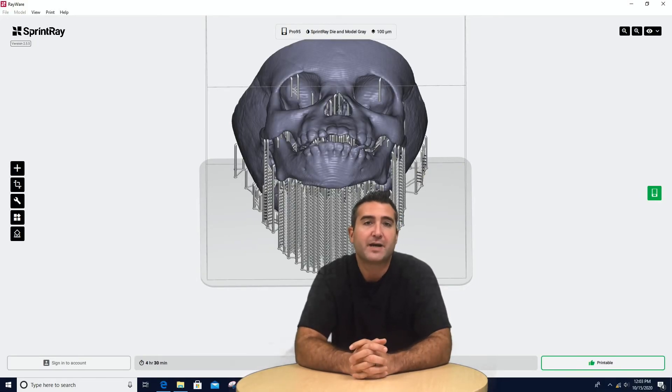Here we can see the file we received back from Romexis — literally five seconds and it fires this thing out. We get it 3D printed and go ahead and look at the model. It's amazing what you can do with this technology.